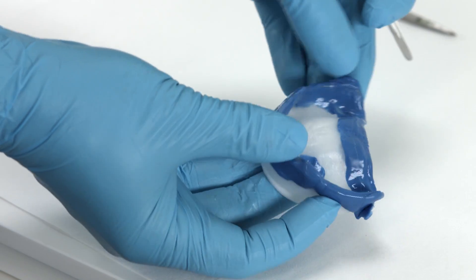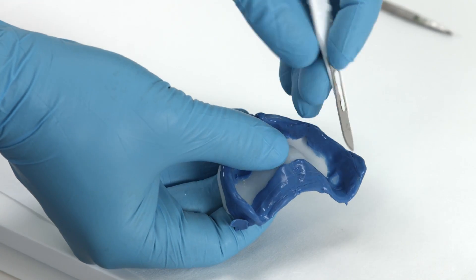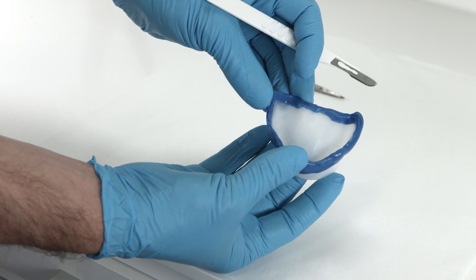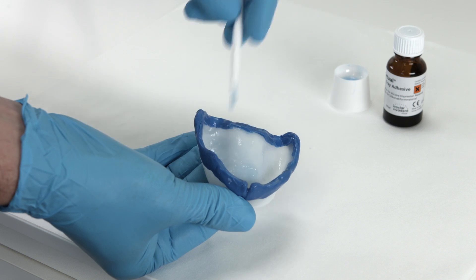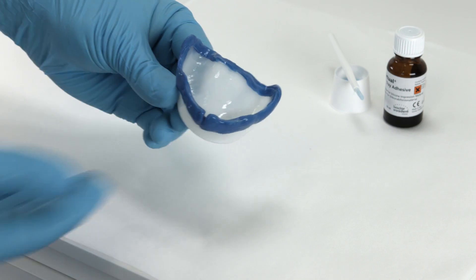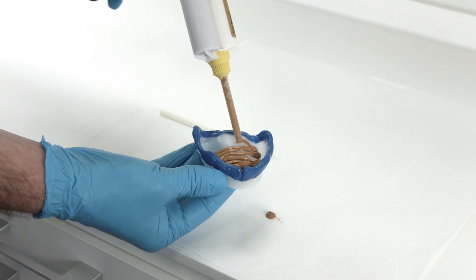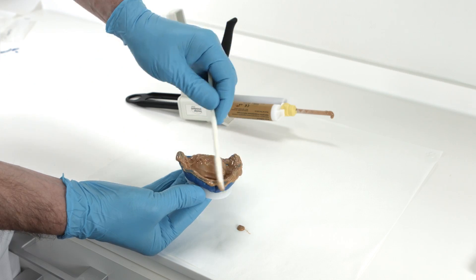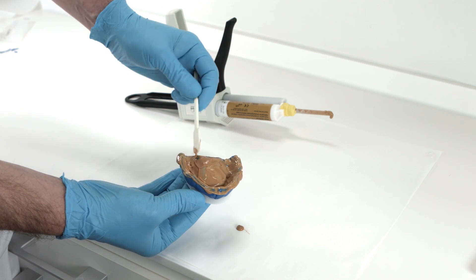Trim the material pressed on the inner surface of the tray back to two millimeters. Excess in the dorsal area should also be removed. Coat the inner surface of the tray with an adhesive varnish and then load it with a low viscosity silicone — for example, Virtual Light Body — for the basic or wash impression.